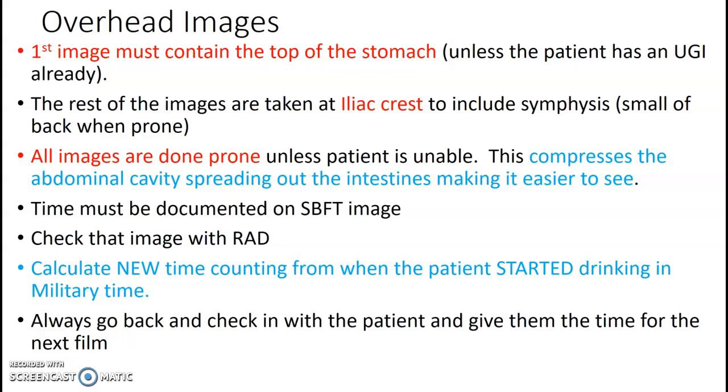The time must be documented on the image itself, so you're going to annotate, right? So to write electronically on your image, you're going to annotate. And it's always done in military time. So if it was a 30-minute at 8 o'clock, you're going to put 30, MIN, the @ sign, 08 o'clock.